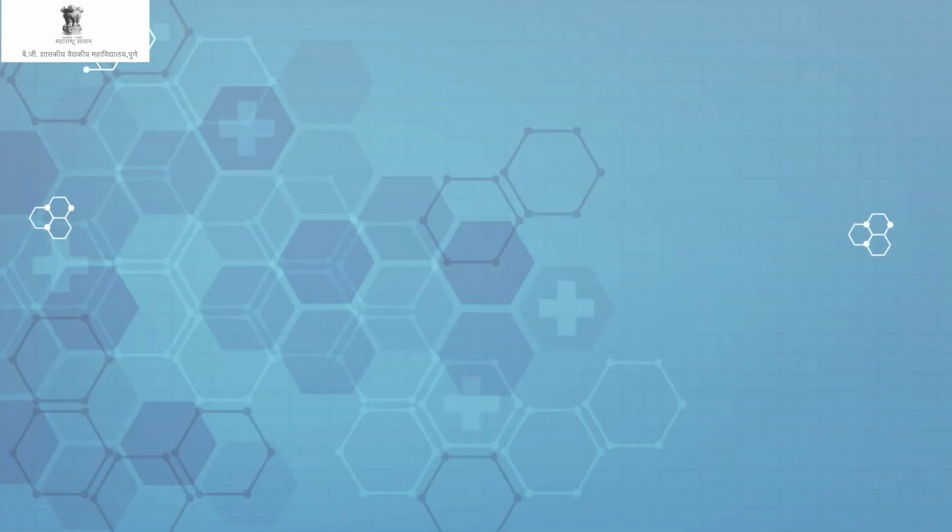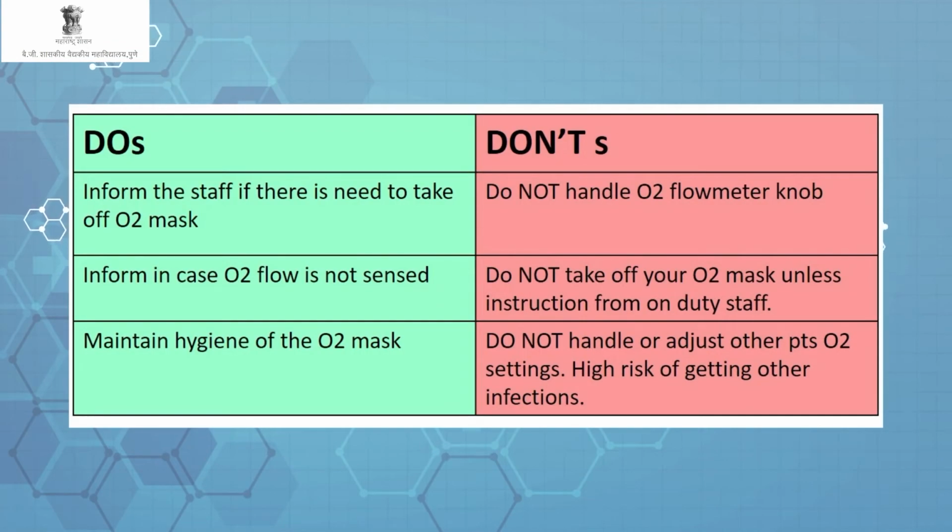Now for the patients, we must display certain do's and don'ts. Every patient must realize the importance of an oxygen bed that they have got. There was a time, and in some places it is still existing, that patients are worsening because of lack of an oxygen bed. Now for the do's, they should inform the staff if there is need to take off the oxygen mask. They should inform in case the oxygen flow is not sensed. Sometimes it may so happen that the outlet is blocked and the patient may not sense any oxygen. So in that case also, the patient has to inform the on-duty staff nurse.